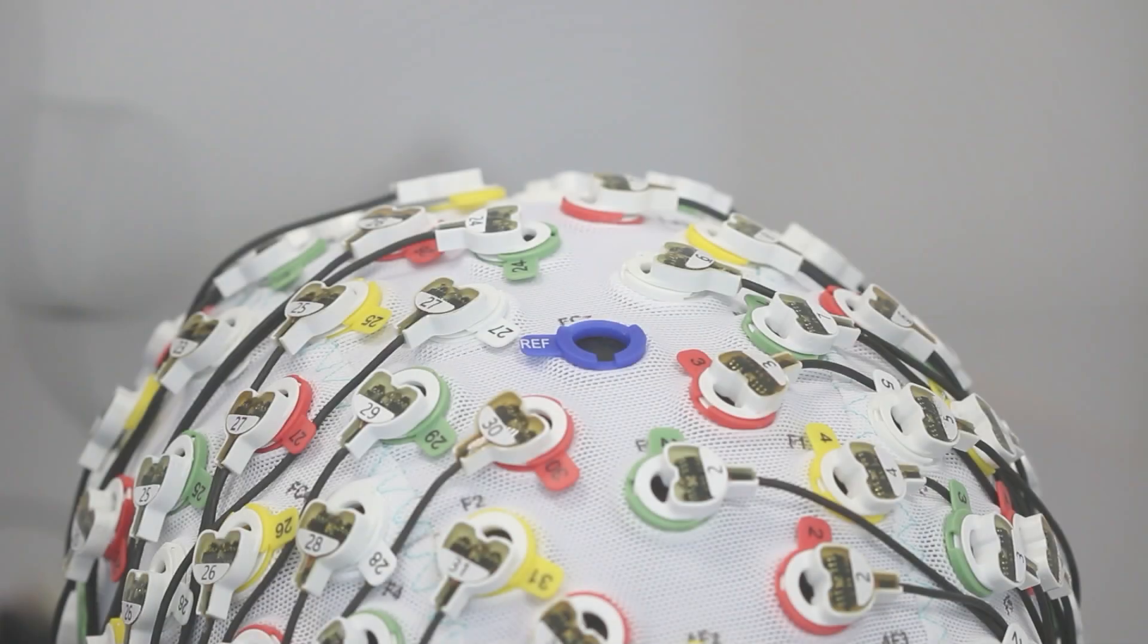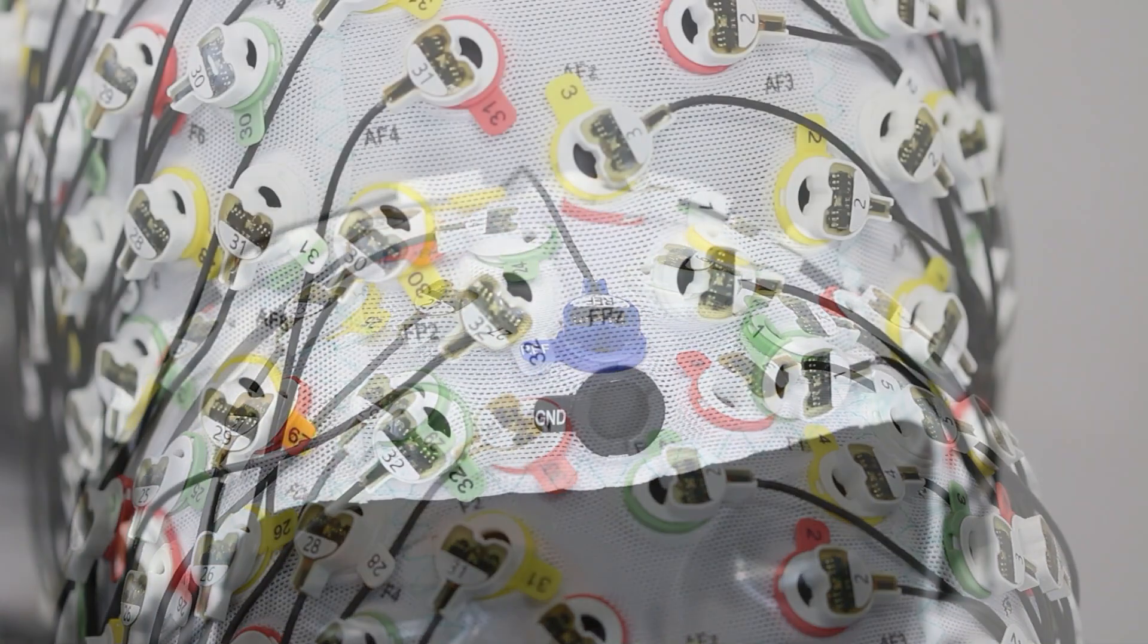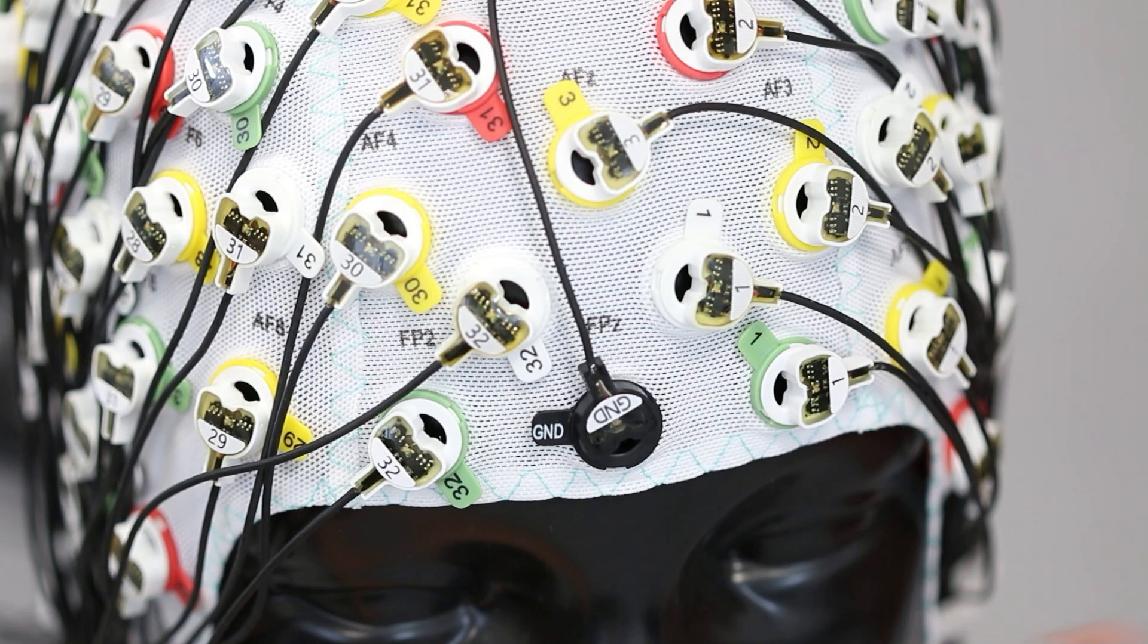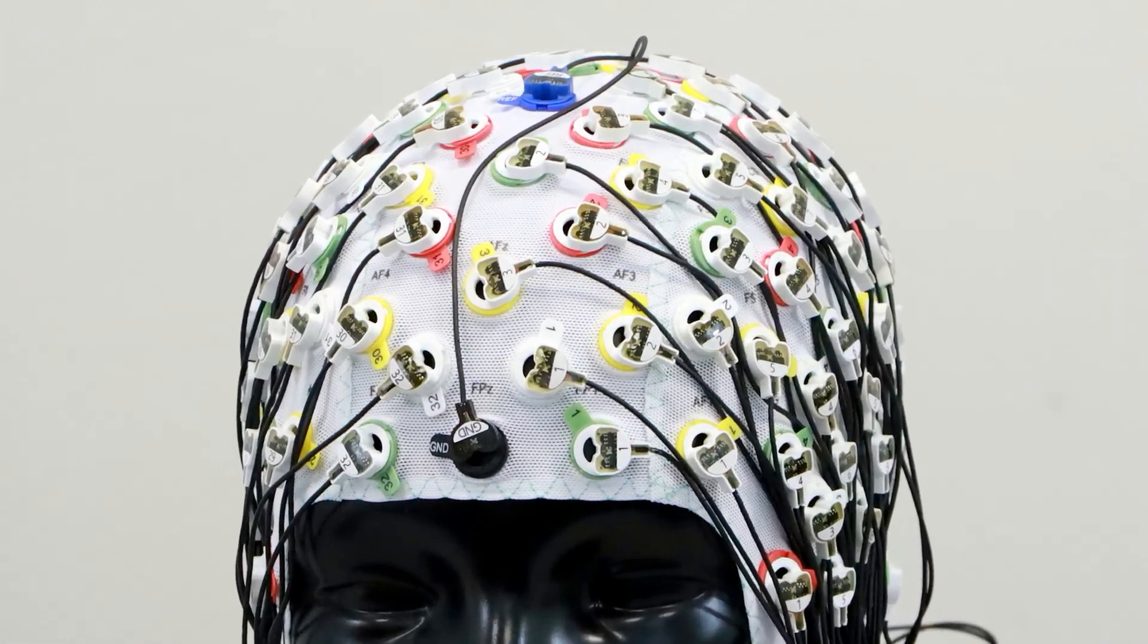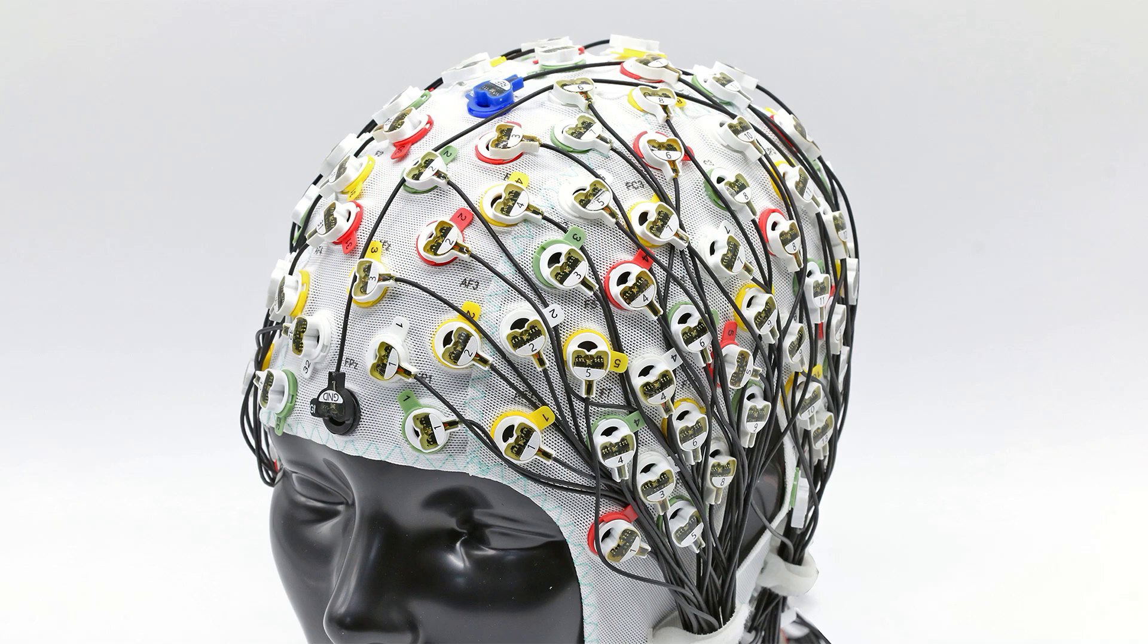Insert the reference REF and ground GND electrodes into the respective blue and black holders last, and let the lead wires route above and behind the head. Follow all the steps till the cap is fully populated.